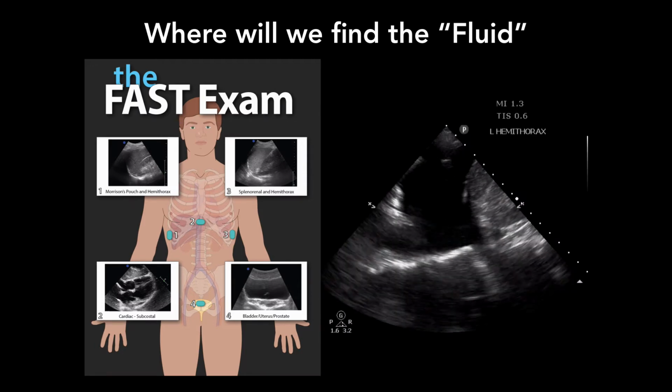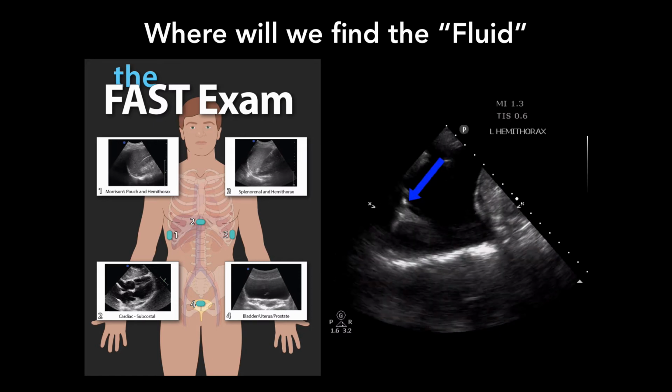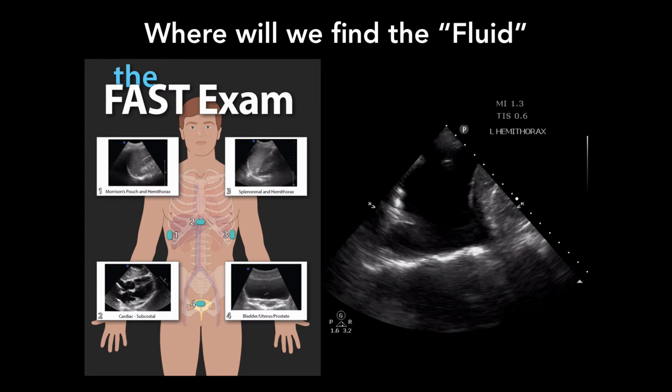What about this? Same thing. So you got spleen. Look at the spine coming up. That's a little easier to see, isn't it? Because it's a lot bigger. What's this stuff floating in the fluid? So what's normally in your chest? Lungs. But we can't see lungs because they're filled with what? Air.